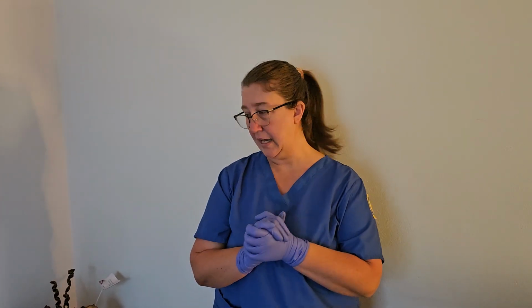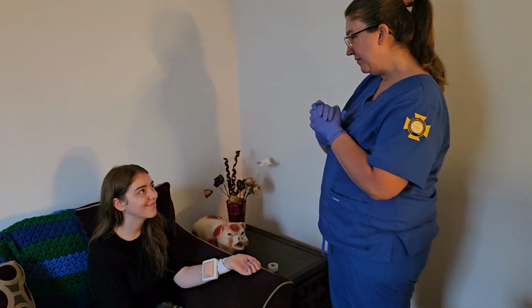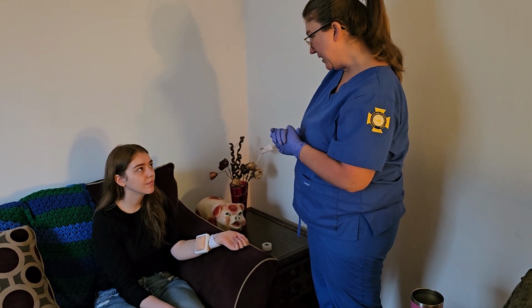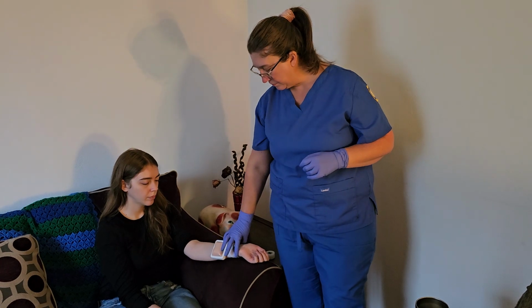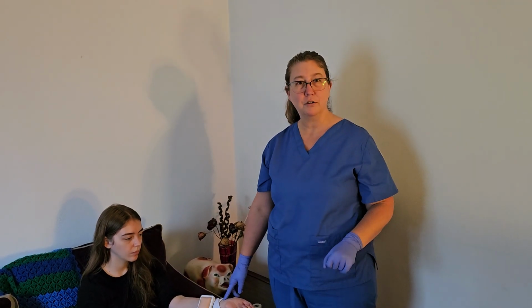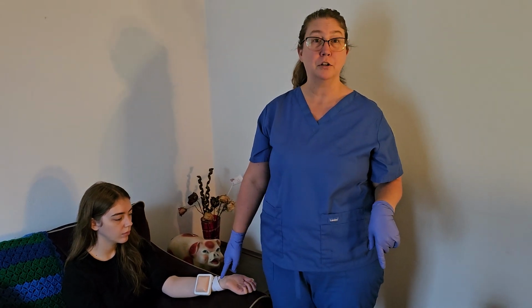Now, while identifying the patient, we want to use our 2 patient identifiers. Good morning. What is your name and date of birth? Catherine, 7/26/1902. Okay. And I check her bracelet, and it is the same as what I have on her record. And I check her patient number, and it's the same as what I have on her record.